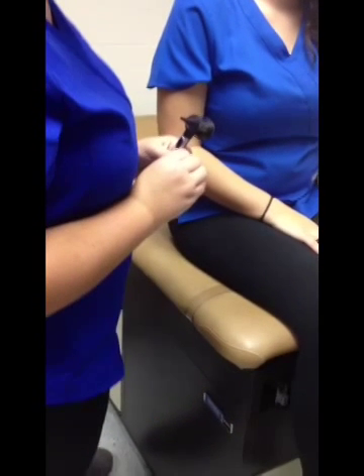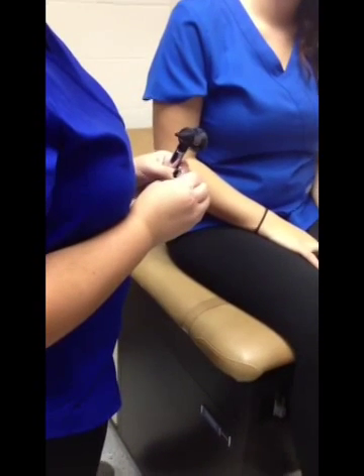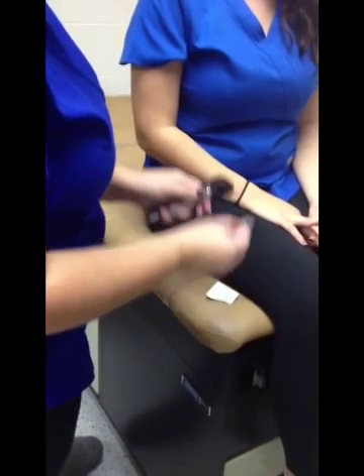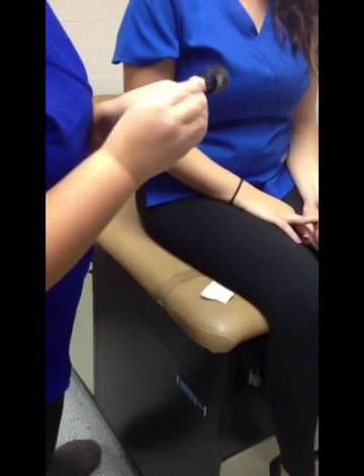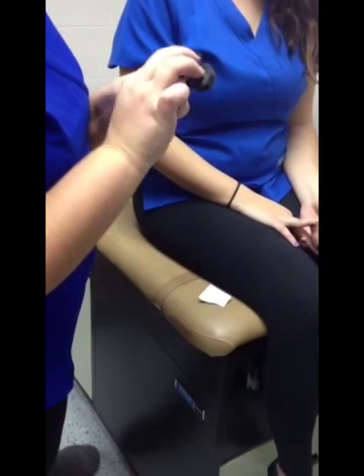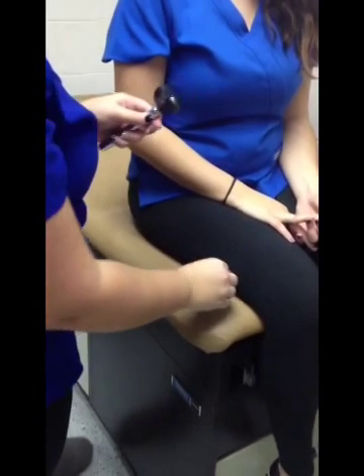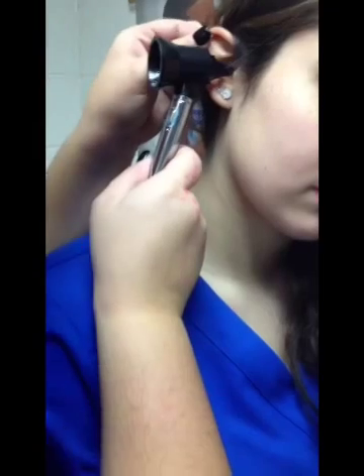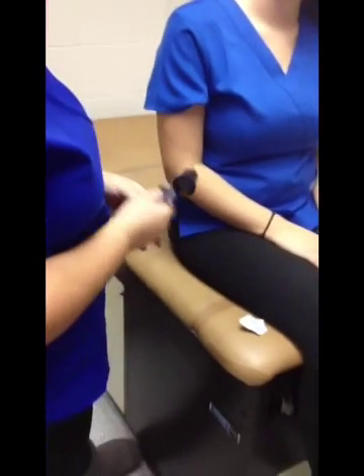After you observe the external auditory canal, you're going to begin to observe the eardrum. You'll use an otoscope, which you need to clean with an alcohol pad. You clean the part that would go into the patient's ear. And then you pull the ear up and out gently and look in with the light in the otoscope. The eardrum should be a circle shape and it should be pink or gray in color.